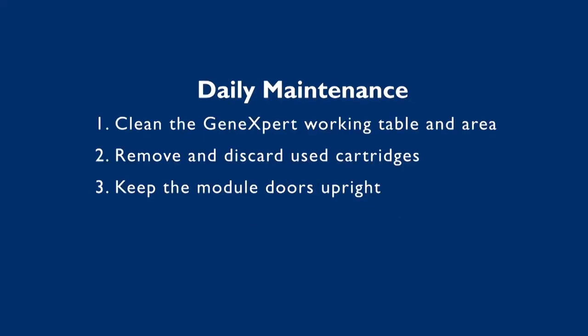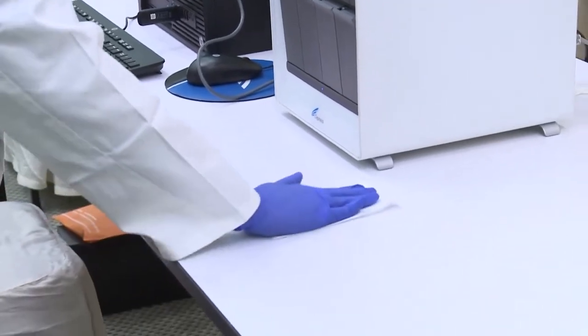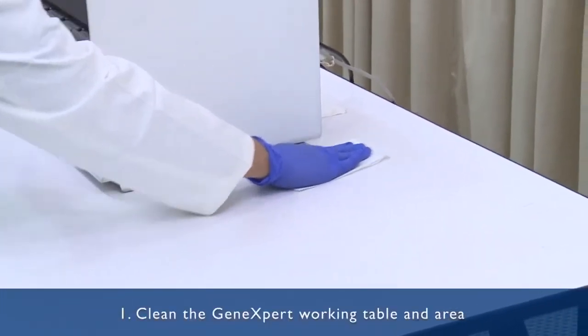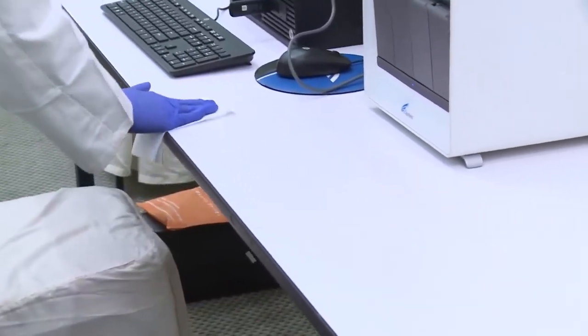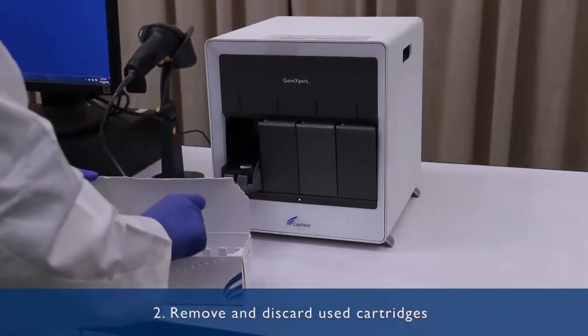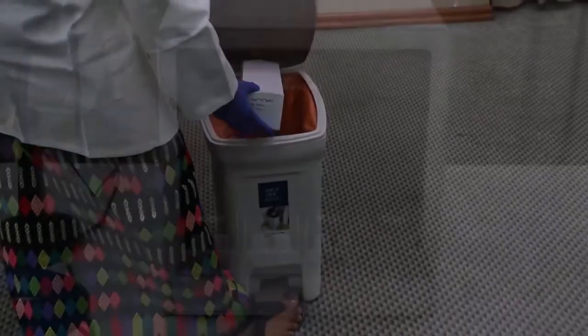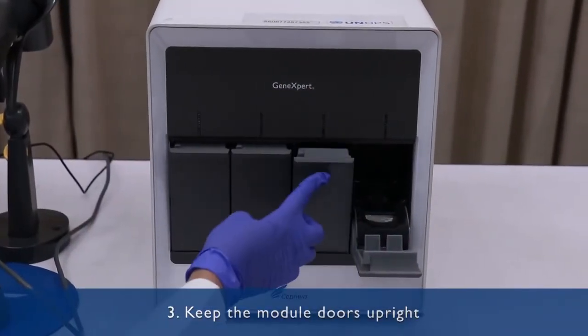Now we will describe the daily maintenance procedures. These procedures are: 1. Clean the GeneXpert working table and area. 2. Remove and safely discard the used Xpert cartridges. 3. Keep the GeneXpert module doors upright.